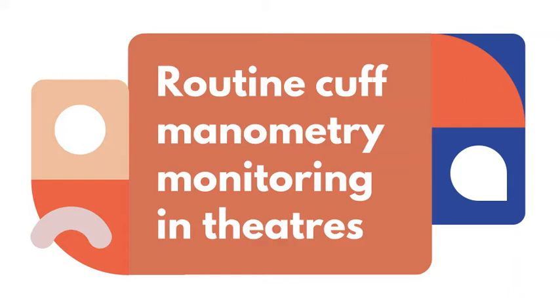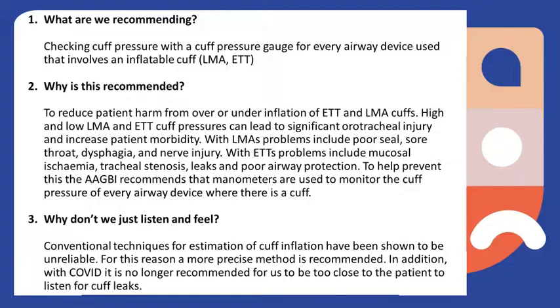Welcome to this short video on how to measure cuff pressures using the manometer. The manometer can be used to measure cuff pressures in LMA and endotracheal tube. In this video, we will be focusing on how to use it with the endotracheal tube.